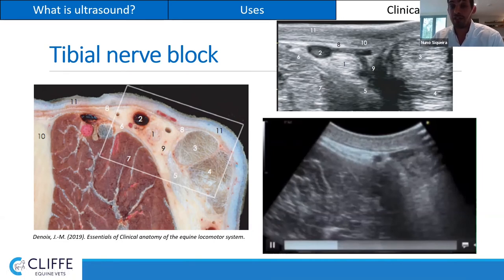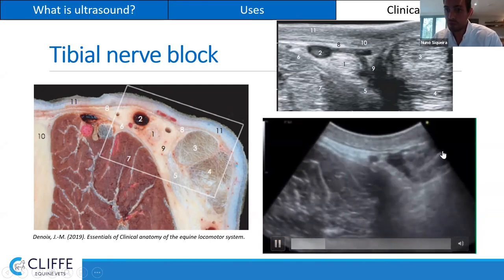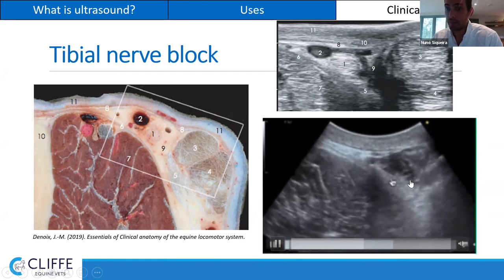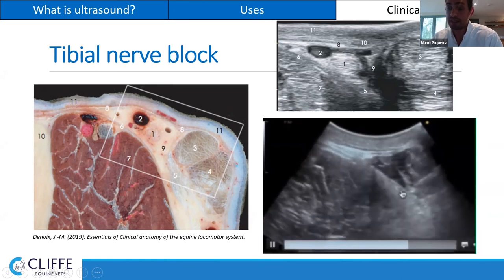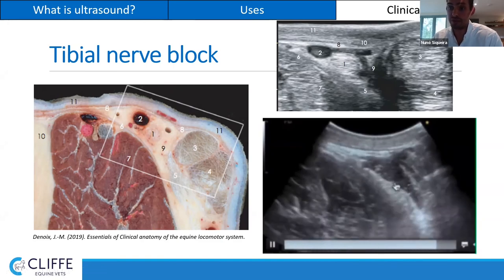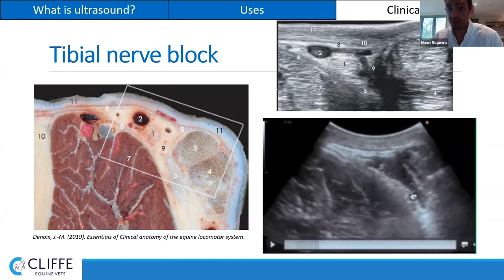and this will mean that potentially we won't be able to put the local anesthesia in the place that we intend, which is why we do it with the ultrasound, as you can see here in the video. You can see on the right the needle coming, and you can see a black pocket that is forming, and that is the local anesthesia that is being put around. You can see the cylindric structure, which is the nerve, and deeper, there's the muscle.